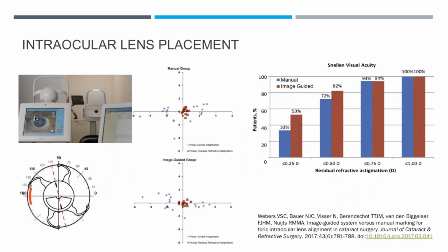In cataract surgery, the navigation is used for correct placement, especially with toric intraocular lenses. And here we can see the results with residual refractive error.